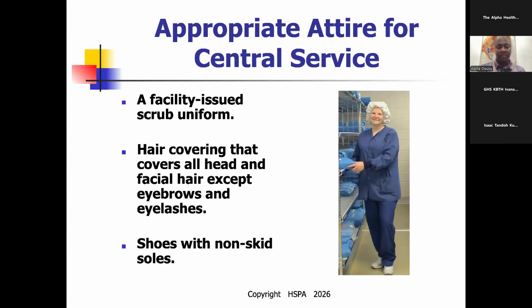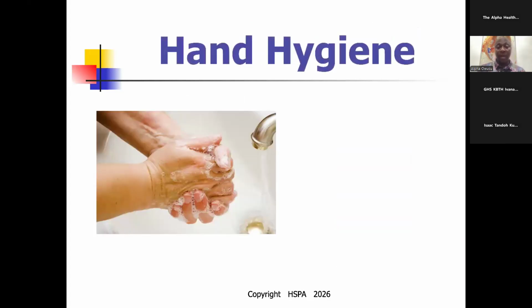Shoes, we have to wear non-skidding shoes, so that we don't fall. Workplace hazard, very, very important, right? We have to wash our hands. You wash in, you wash out, right? Before you handle the instruments, and you don't want to wear gloves, you have to wash your hands, right? And then you handle the instrument. The reason why some people don't want to wear the gloves, there have been a lot of events where you have pieces of the gloves ending up in the tray, get sterilized. And then when they open it on the sterile field, you see parts and pieces of the gloves, right? And so, yes, we understand.